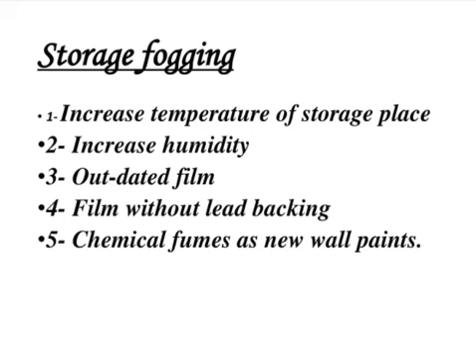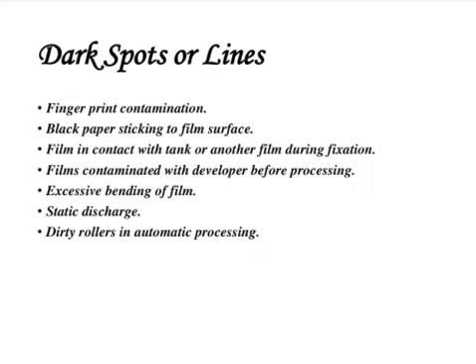Films without the lead backing, like the extraoral films, have more chances to get fogged than the intraoral films. Chemical fumes, as in new wall paints, can also result in some kind of storage fogging.